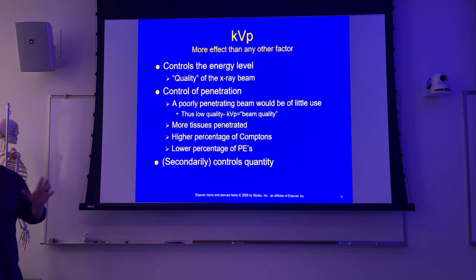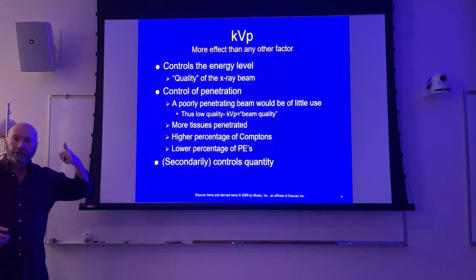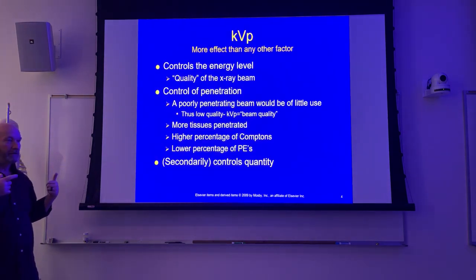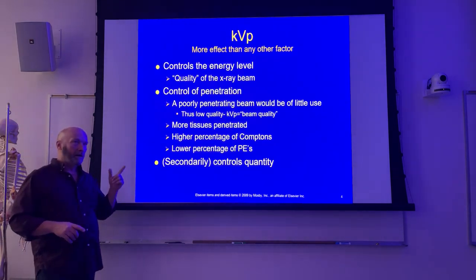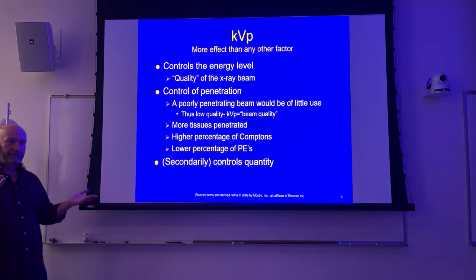The different words for different types of contrast, we'll discuss here in a minute. So unfortunately, the higher the kVp goes, you remember talking in the last section about how increases in kVp decrease interactions all the way across the board, right? But what you get is a disproportional number of Comptons to photoelectrics.